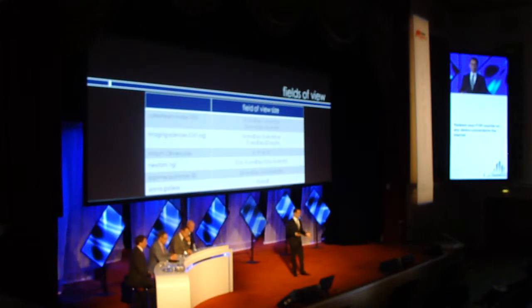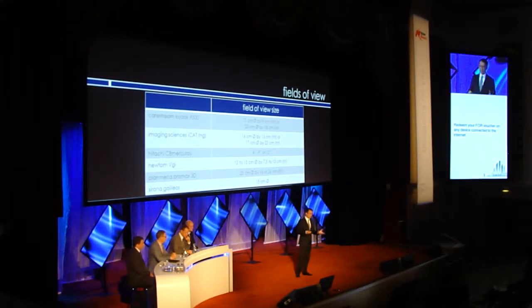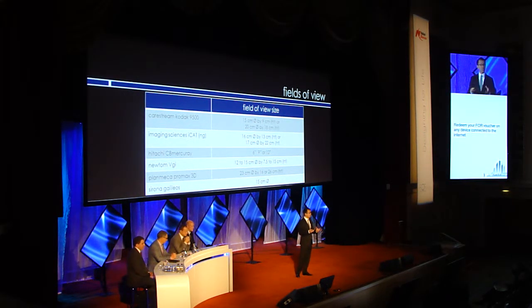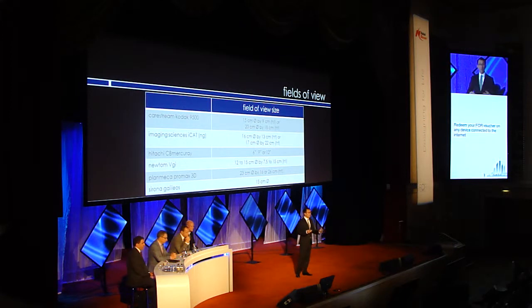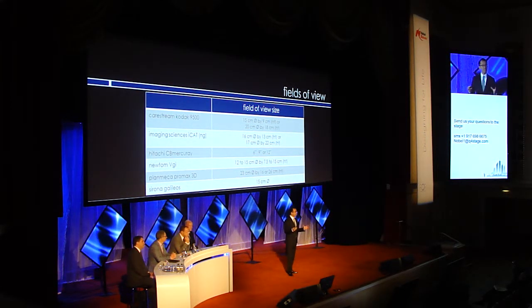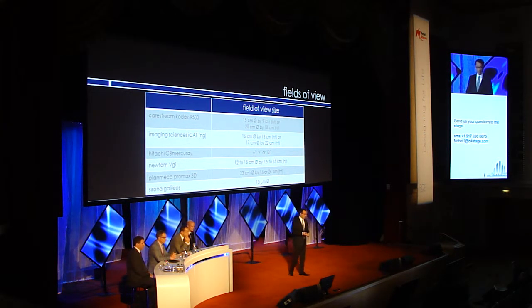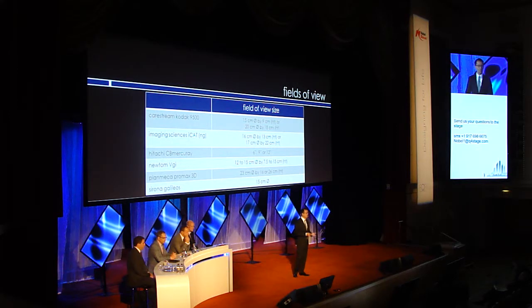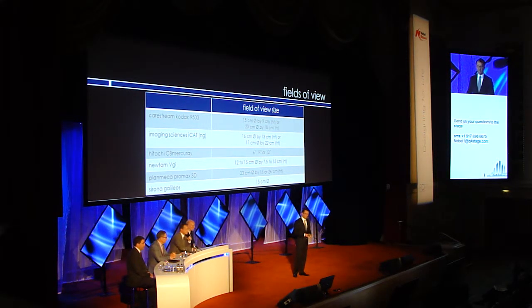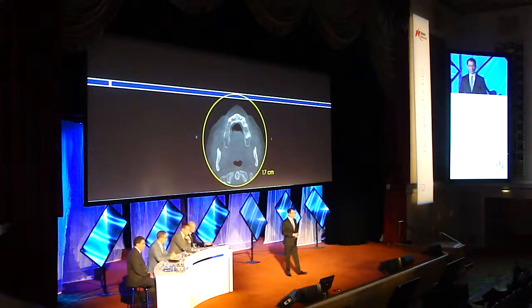These have been made by a number of different companies, and these are some of the examples. The smallest of these systems may have a 6-inch diameter sphere, whereas the largest ones of these systems may incorporate a 20-centimeter diameter field by 18 or 22 centimeters in height. These are very, very large fields, and they can encompass, as I've said, the entire human head. 17 centimeters is pretty big.